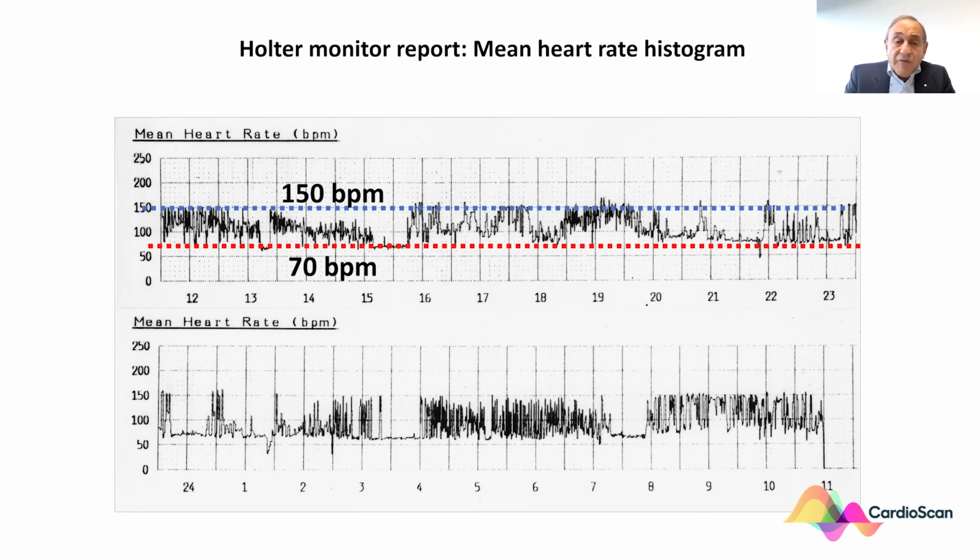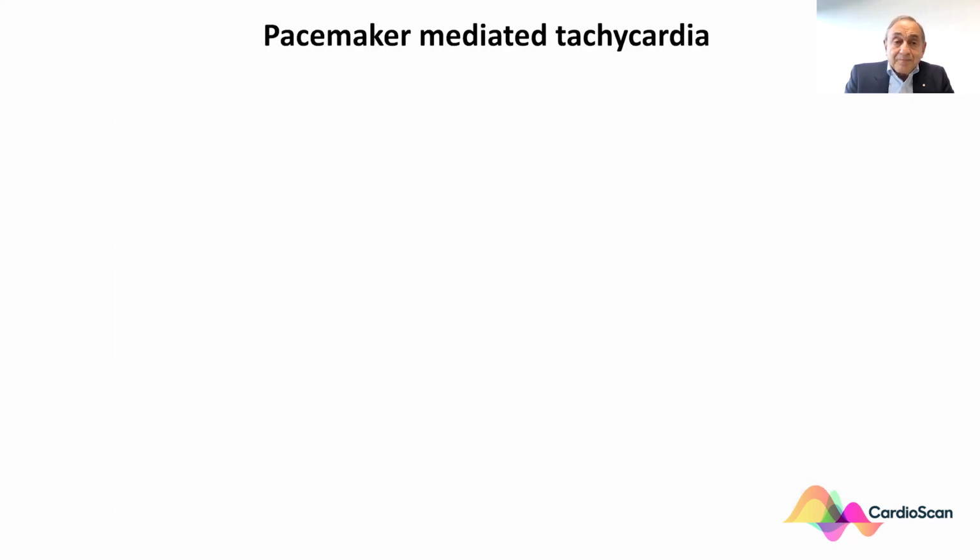And there is often a sudden onset from the low rate to the upper rate. This may be caused by a pacemaker-mediated tachycardia.